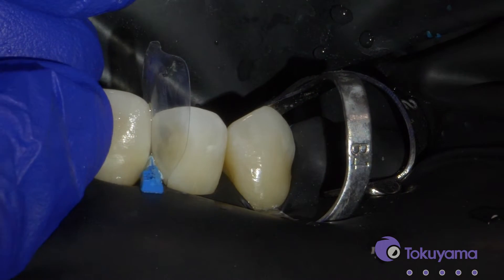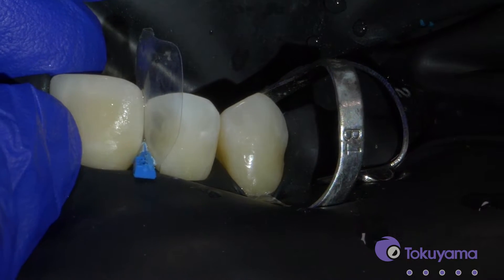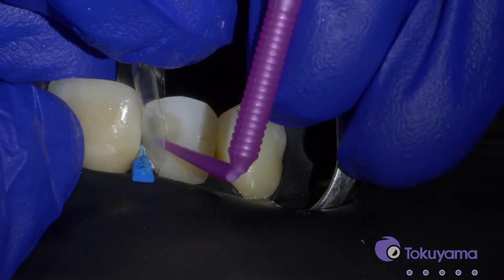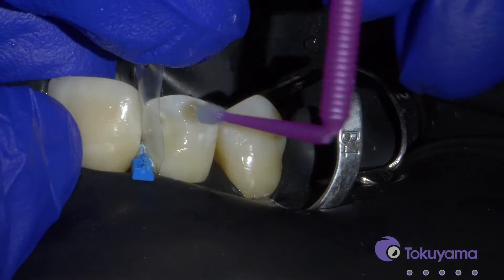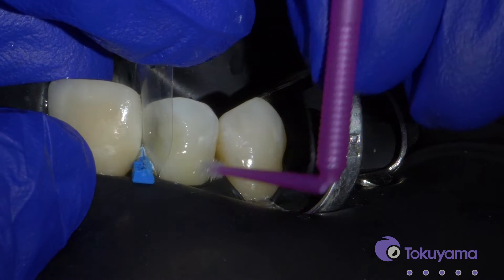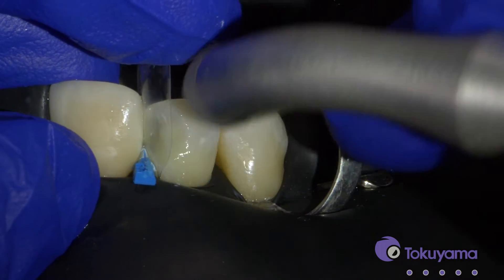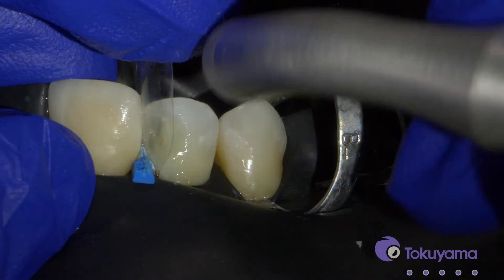So now we're going to apply the Tokuyama Universal Bond. My assistant is just mixing those two bottles right before I'm actually using that — just a drop from each of the bottles — and then we just apply it to the tooth and it's going to be really, really strong. We don't even have to really rub it in, just get it on all the surfaces of the tooth, and then we'll just do a gentle stream of air.